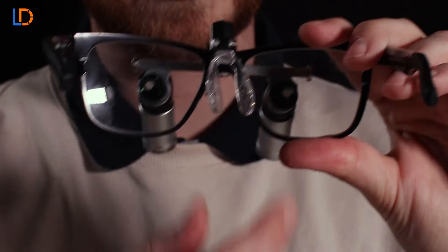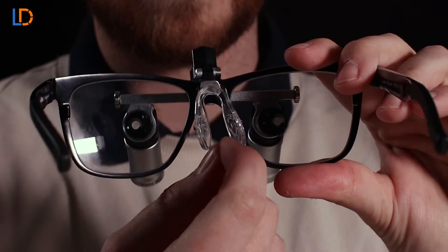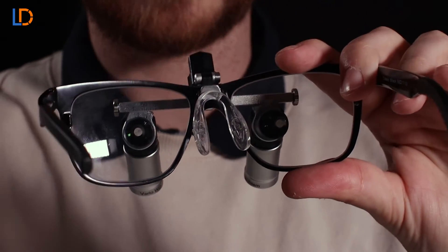Now the second thing you're going to want to notice is this adjustable nose pad. If you pinch this nose pad in, it will allow the loops to sit higher on your face, and if you widen them it will allow the loops to sit lower on your face.